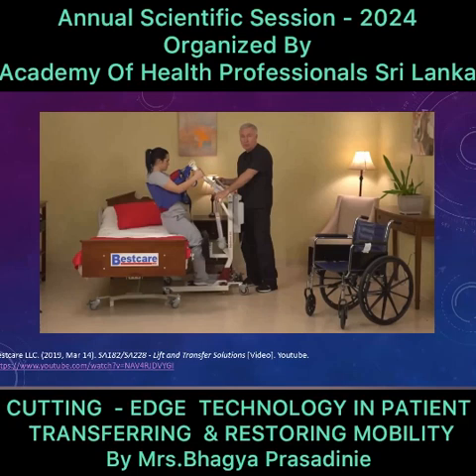When you're using this machine, you need to make sure that your patient is having proper leg strength to use the machine. And if the patient does not have the leg strength, especially the balance, I'm sorry. Especially if the patient is having balance issues, of course, we can use this machine with proper leg strength.